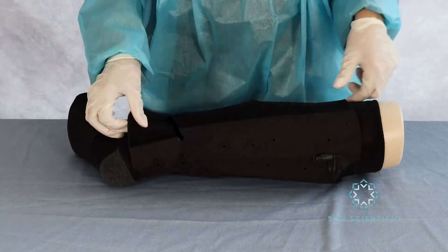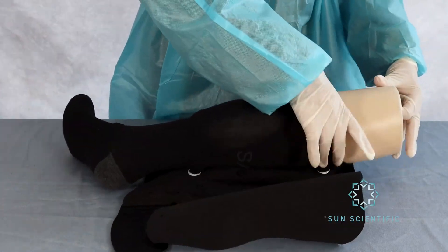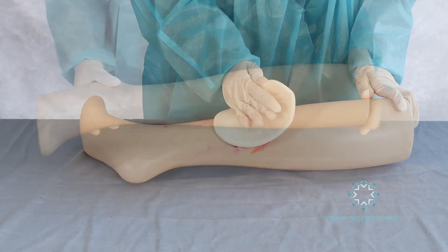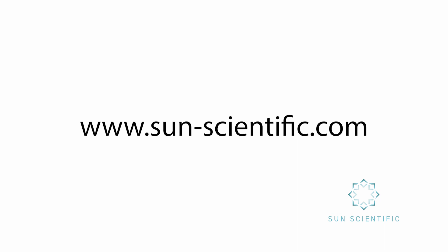Carefully remove AeroWrap when you are ready to discontinue use or for things like showering. Then remove PFAB when it is time and discard it. Clean the wound and repeat the application process. Visit SunScientific for more information.